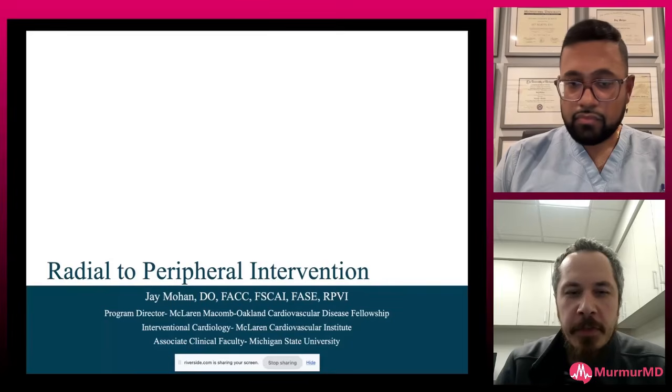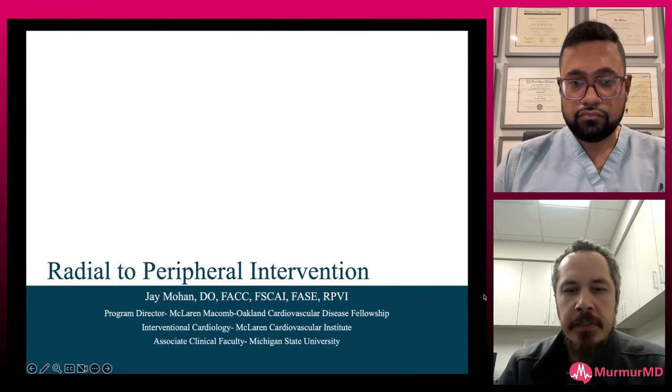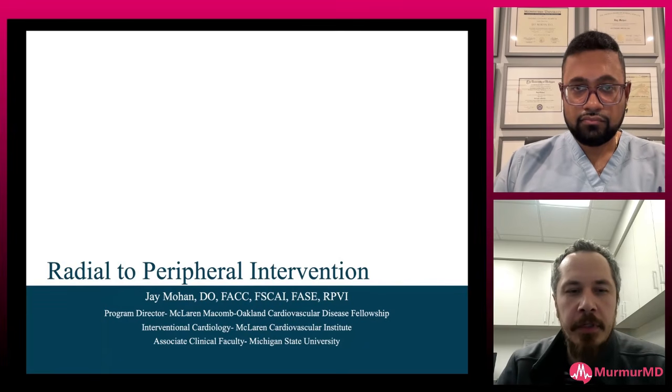Dr. Mohan, thank you so much for setting the stage for how to do a good intervention and CTO of the iliac. You promised us one or two cases, so we'd love for you to walk us through your approach of those complex interventions.